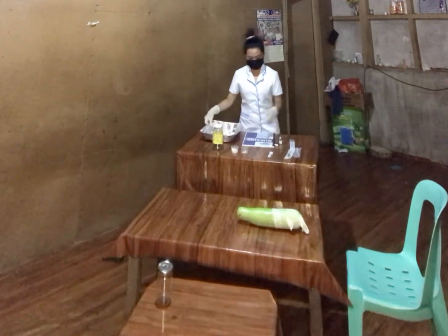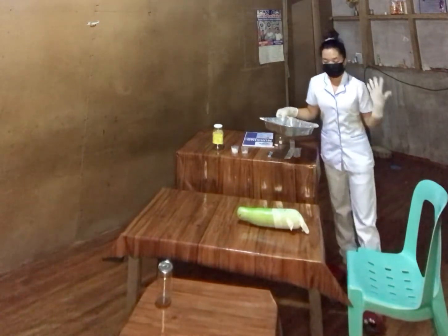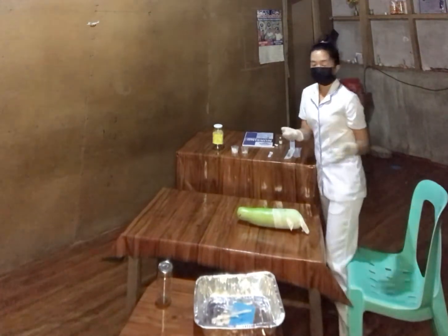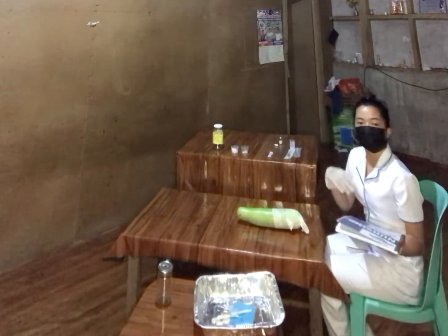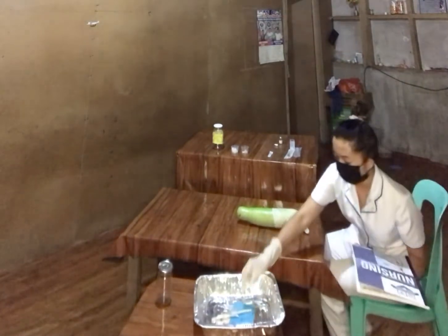So I will put this tray with the patient. So write the medication ticket. On the medication ticket, put the name, the drug, and the dosage, so that we won't forget the medication we administer.